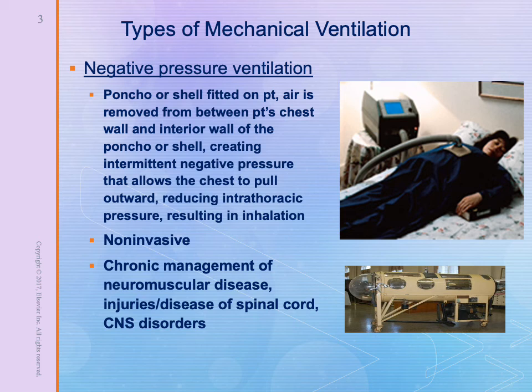The bottom photo is of the iron lung. The iron lung was created in the late 1930s or 1940s to treat patients with polio. The patients were placed in a cylinder and negative pressure was applied.